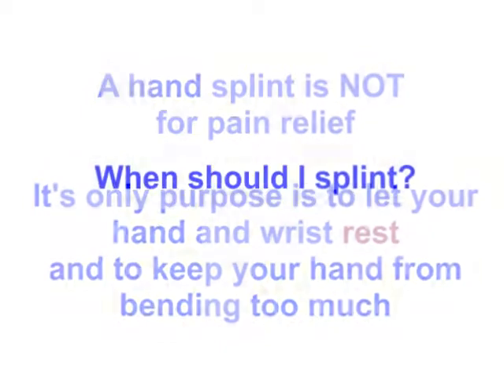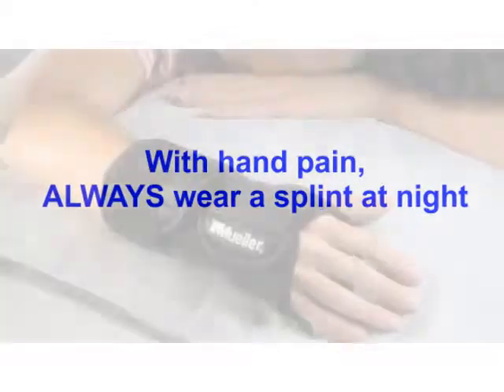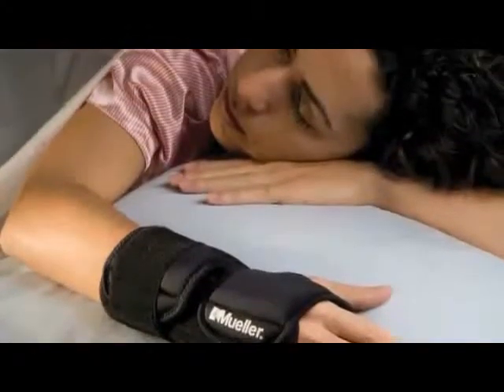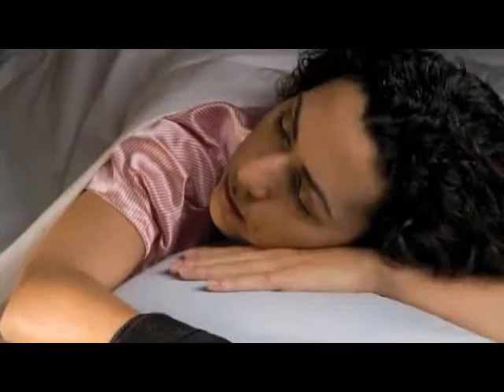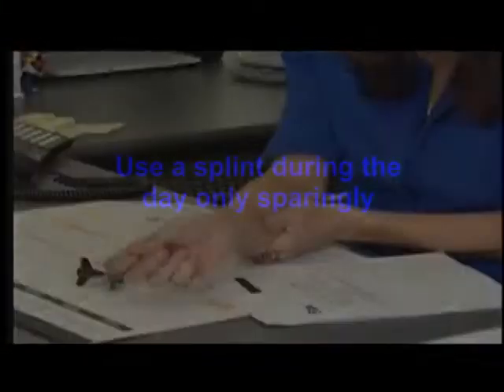As a rule, everyone with hand pain should splint at night while they sleep. Most people flex or extend their hand while they're sleeping, and this will impair the healing process. So to keep your hand from bending, night splinting is crucial to having healthy hands. In contrast, if you use a splint during the day and insist on straining your hand, then fighting the splint is going to be a lot worse for the healing process than not wearing a splint at all.